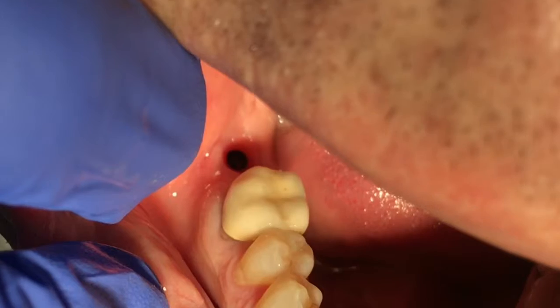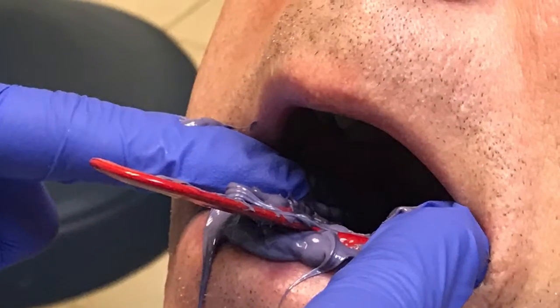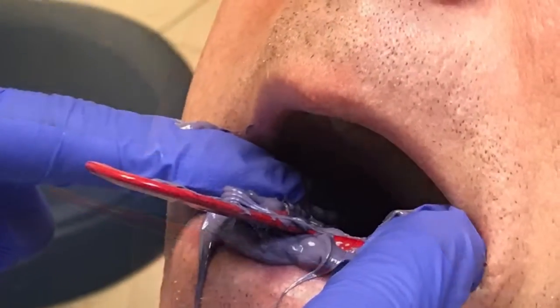Taking an x-ray, confirm everything, and you are ready to take the impression. This was a really quick video just for you guys to have an idea what type of tissue you are looking for when you take off the healing abutment and are ready for the final impression. Thank you. Take care.